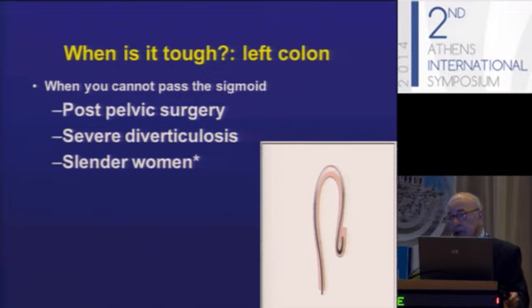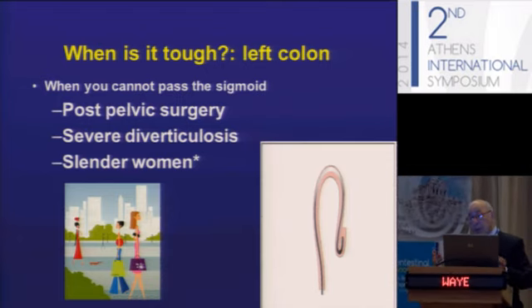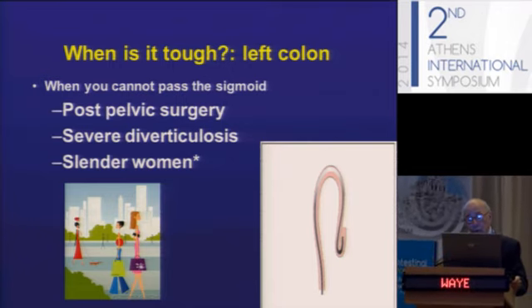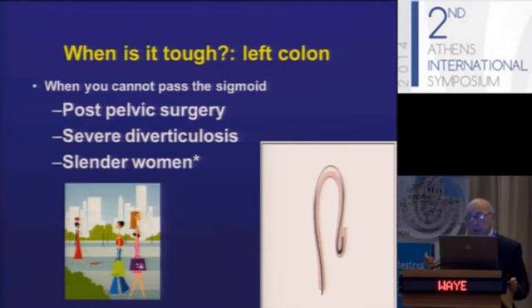It's difficult in the left colon in patients that have pelvic surgery, severe diverticulosis, or slender women. Slender women are especially difficult because not only do they have a smaller abdominal cavity than men, but they also have extra organs in the abdominal cavity that makes colonoscopy somewhat more difficult. Besides which, a long time ago, Christopher Williams did a study with his radiologist, Dr. Bartram, and he found that the colon in women is longer than the colon in men. So it makes for an especially difficult colon.